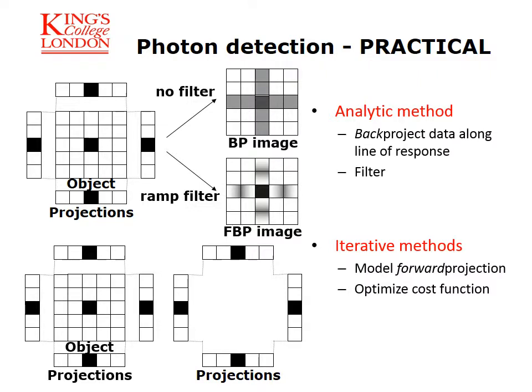Filtered back projection is quick and very quantitative, but as you can see over there, the stripe artifacts are not entirely eliminated, and they disturb the visual assessment of an image, particularly when the distribution of radioactivity is quite heterogeneous. Iterative reconstruction images instead have great visual appeal, but the technique is very slow to converge, particularly for small radioactive objects. Noise instead is very different from filtered back projection, as it is quite speckled.